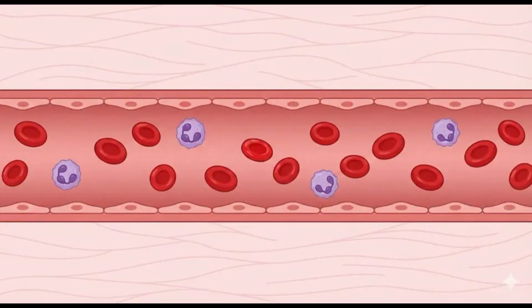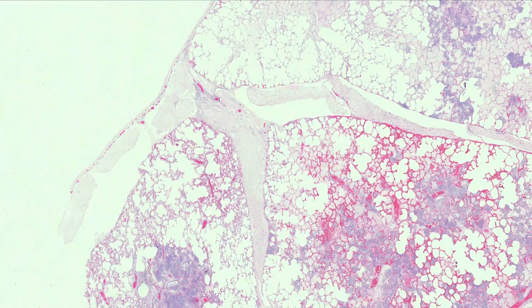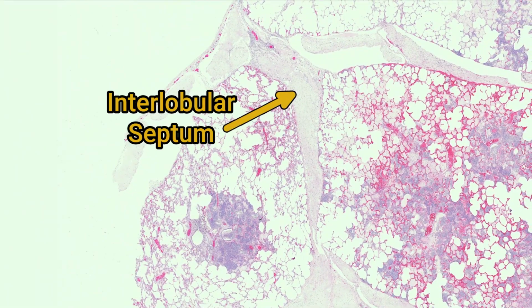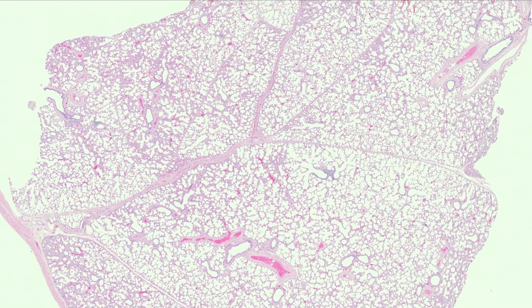Blood vessels also need to become more permeable to allow fluid, cells, and other components from the bloodstream into the affected tissue. Endothelial cells contract, creating gaps between them and allowing fluid into the tissue. This is edema. In the example that we're using, I think the edema is best appreciated in the interlobular septa. Cows have very partitioned lungs.